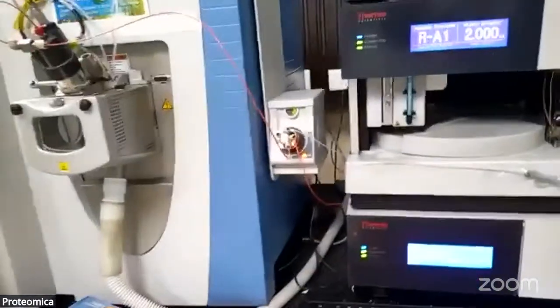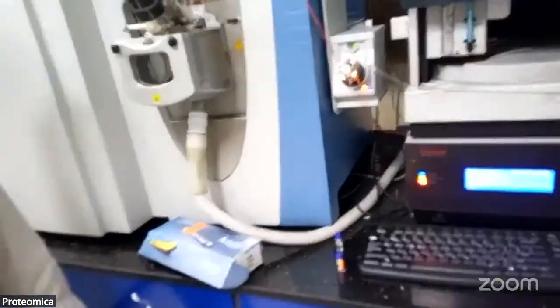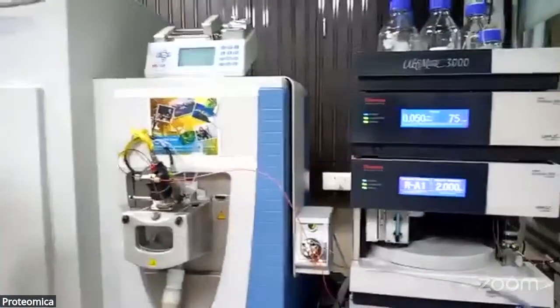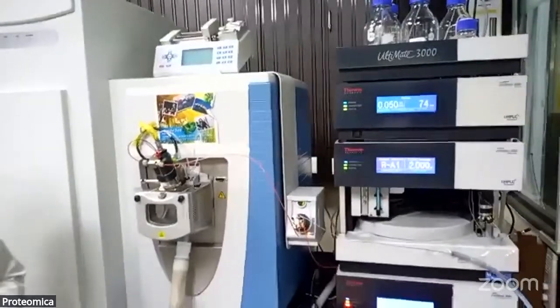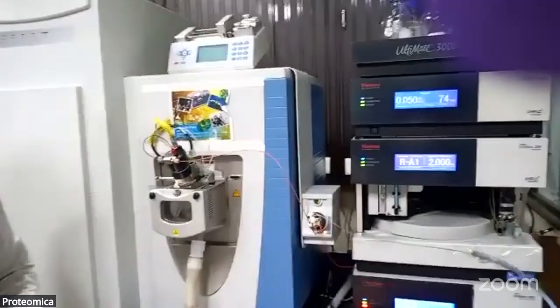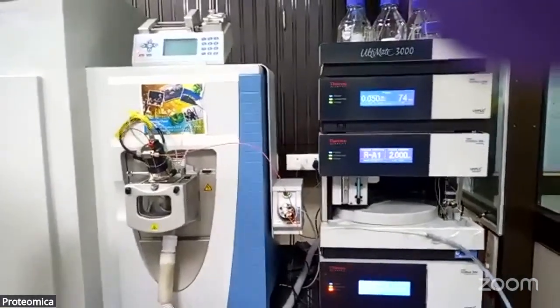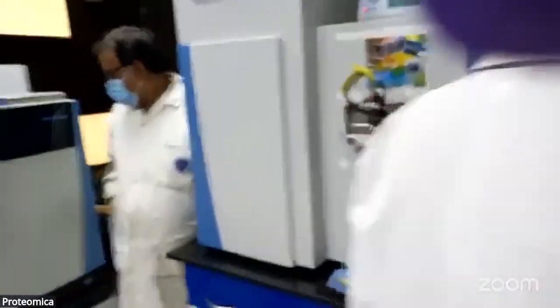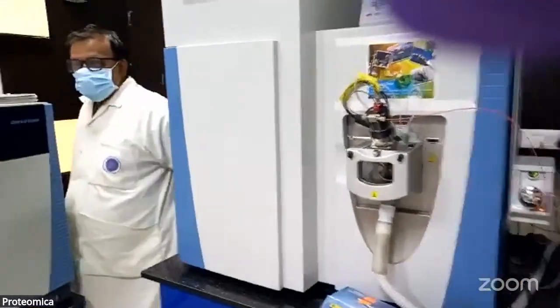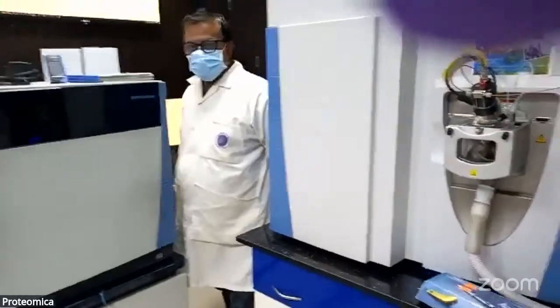So once you get the metabolomic profiling, you know what all metabolites are there. Using the MetaboAnalyst software for the data analysis protocol, you can use various searches such as LipidSearch for lipidomics, and Compound Discoverer for the metabolomics for tabulation.